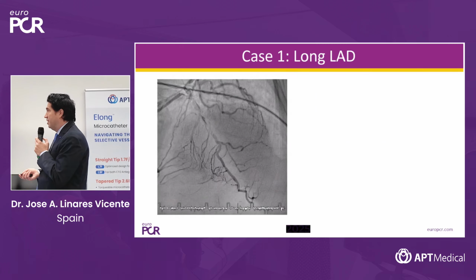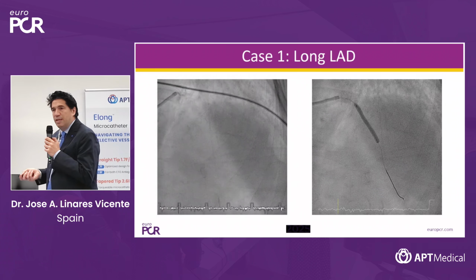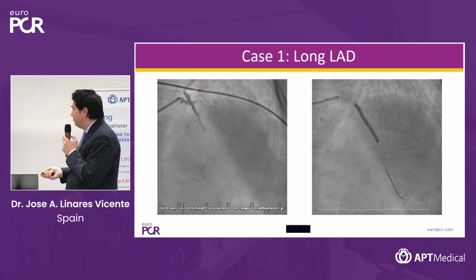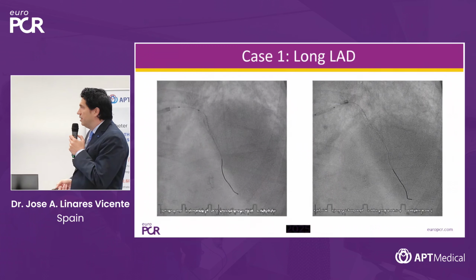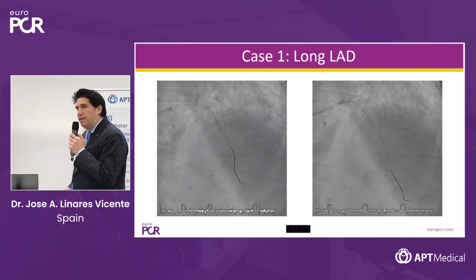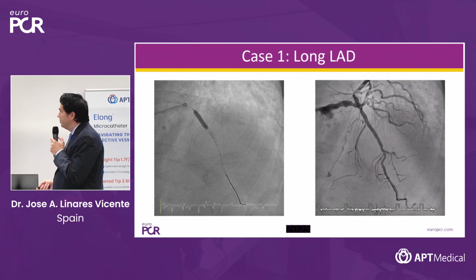It's not a very tortuous anatomy. It's a long lesion. We implanted a stent. Obviously, there was a proximal severe malapposition due to the vessel size mismatch. We tried to use a regular NC balloon, and as you can see, the balloon doesn't advance, and see how the CONQUEROR literally jumps into the stent, permitting an adequate proximal optimization technique and an excellent final result.